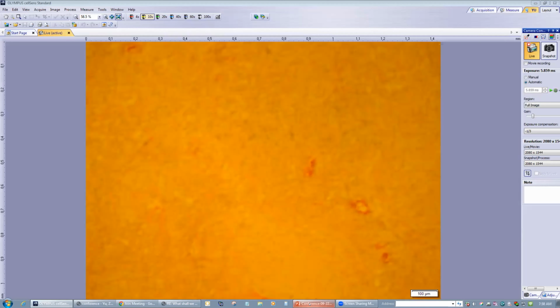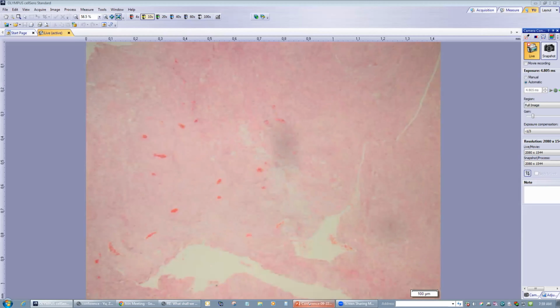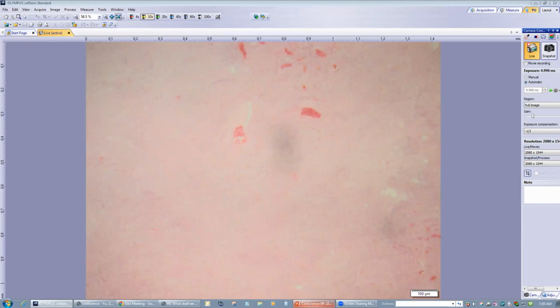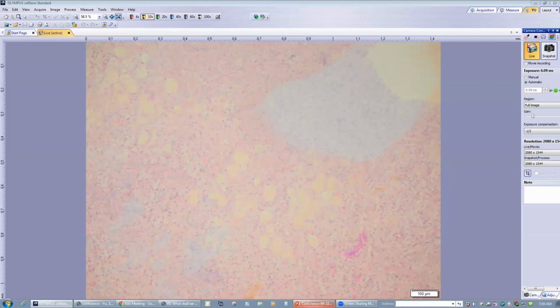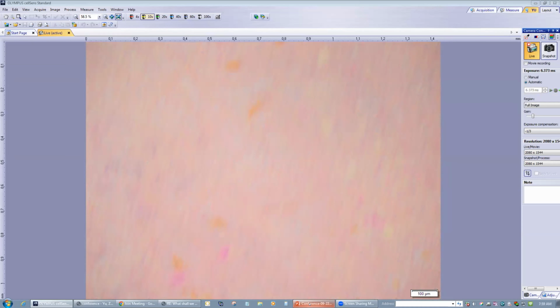I have this case in my study set. It's a very classic type of AML. It's a tumor resection, not a partial nephrectomy specimen. On low power, you will see fat and vessel, the angio part.